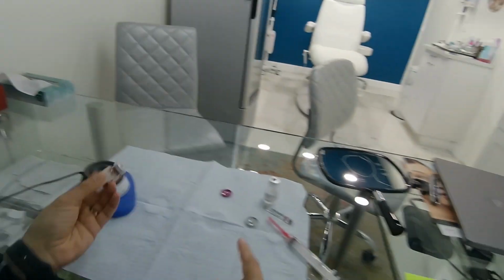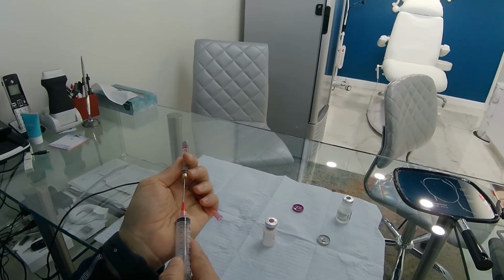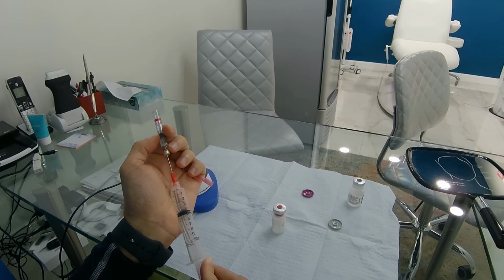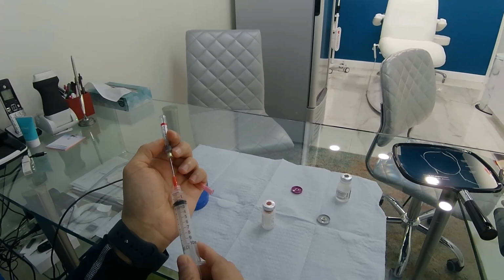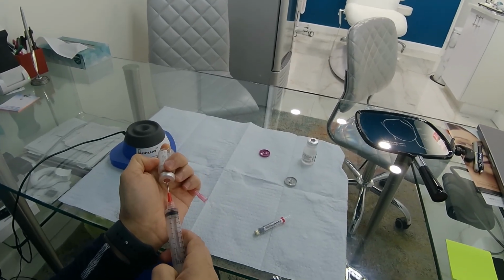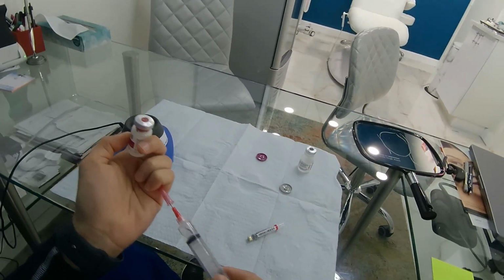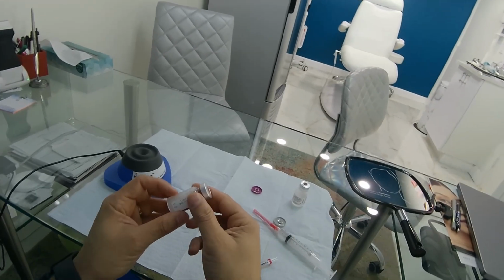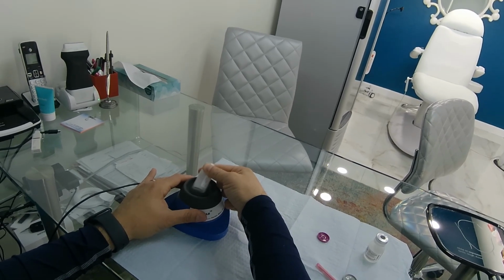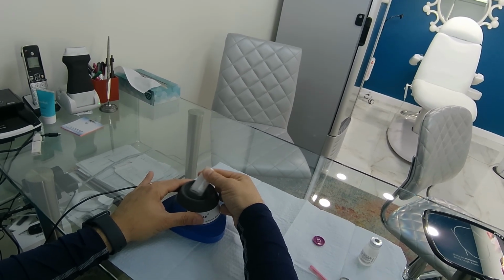After I mix that, what I'll do, and I can do it now because I have a patient that I'm going to inject, so again, I'll take 1 cc from the Lido, and this is really very handy to have in small ampules like this. What I'm going to do is again just release the air. I'm not going to use this again, so I left a little epi, so I put only 1 cc of lido with epi, and then I'll mix it as well. So now it's the Sculptra particles with the sterile water and lido with epi.